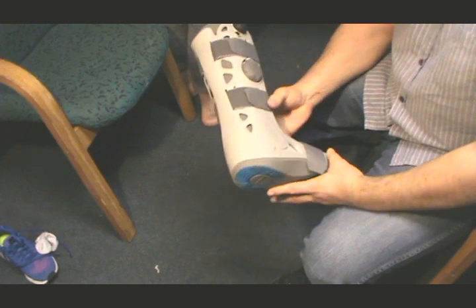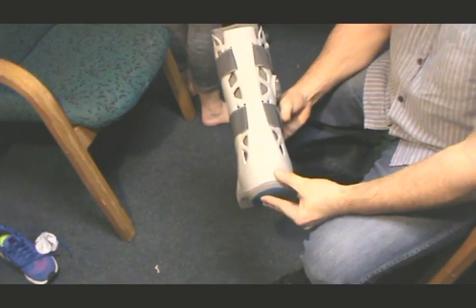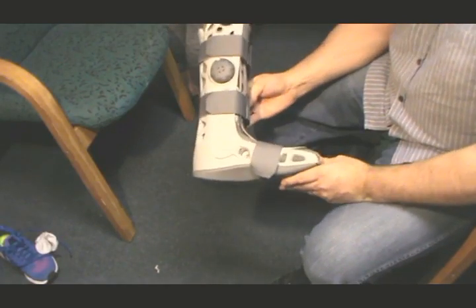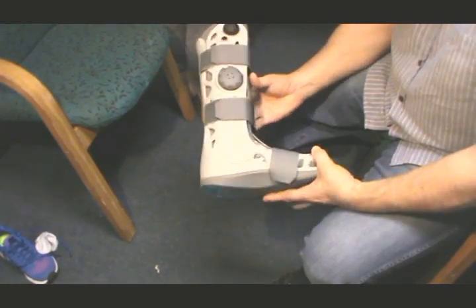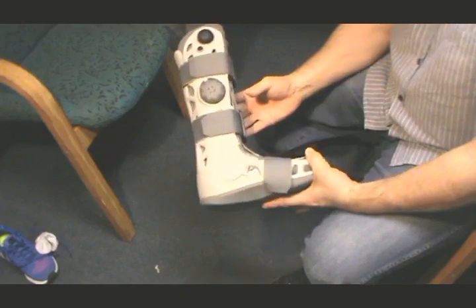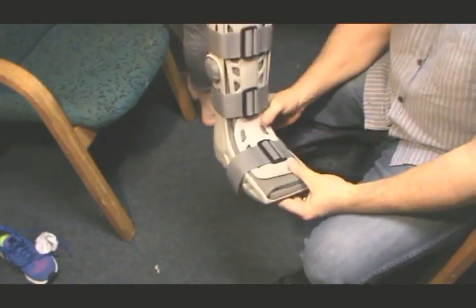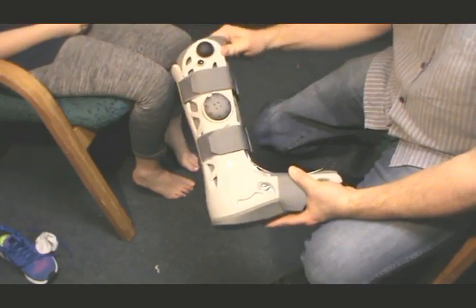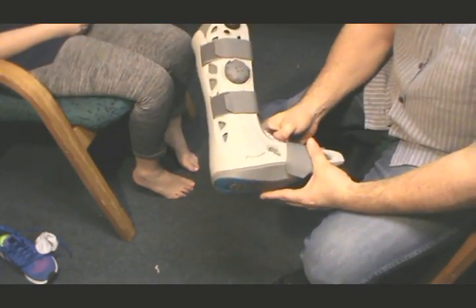We're going to talk now a little bit about the fracture walker. It's the air cast fracture walker made by Don Joy. These are the ones that we use the most. There are many other different types of brands, but we find that this one, out of all the boots, is probably one of the most stable for any kind of fractures.